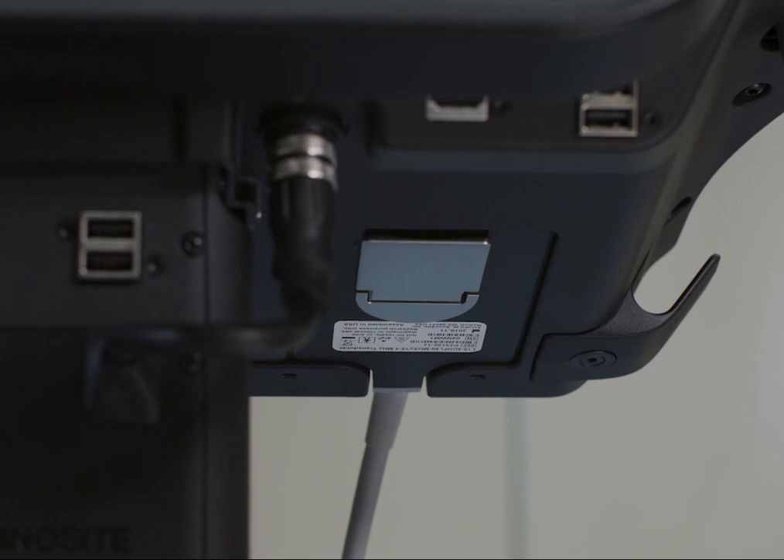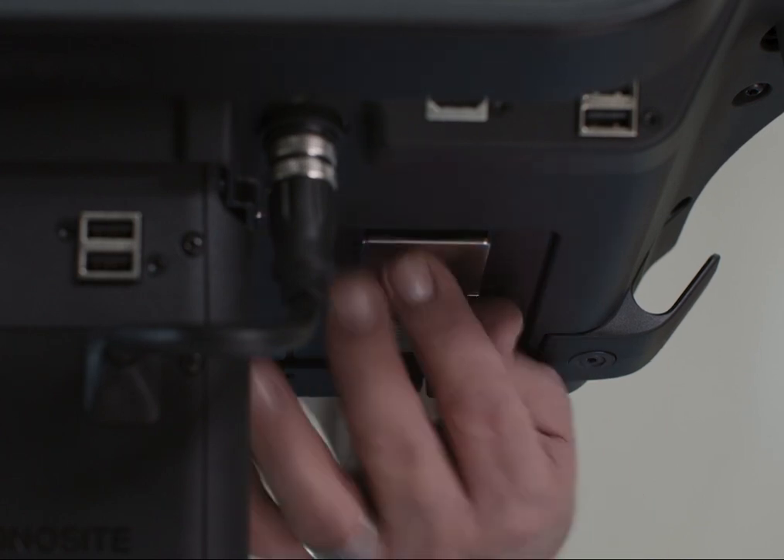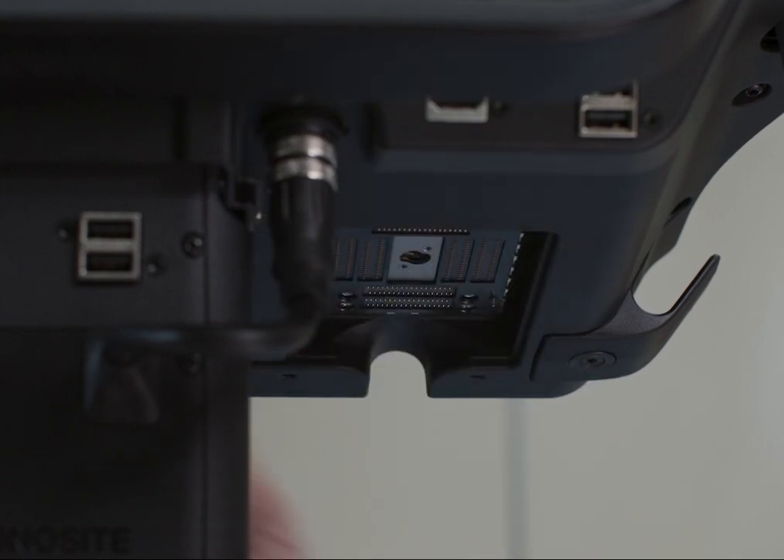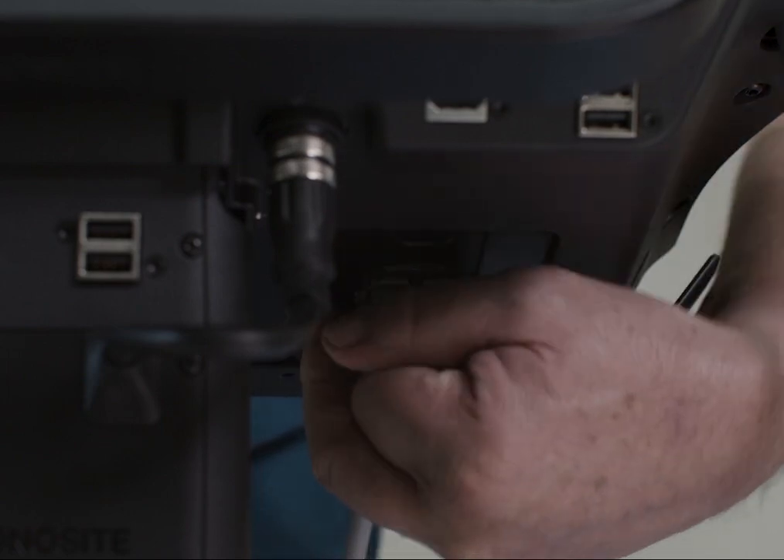Now let's change the transducer. Start by lifting up the latch on the transducer connector. Turn it 90 degrees clockwise and then pull the connector out. Then reverse the process to connect the new transducer.